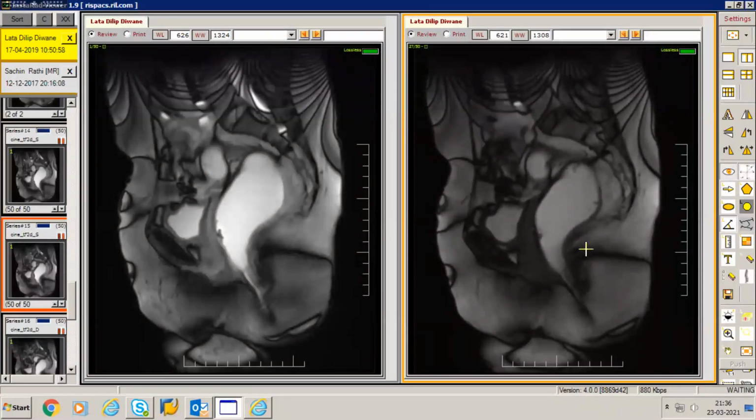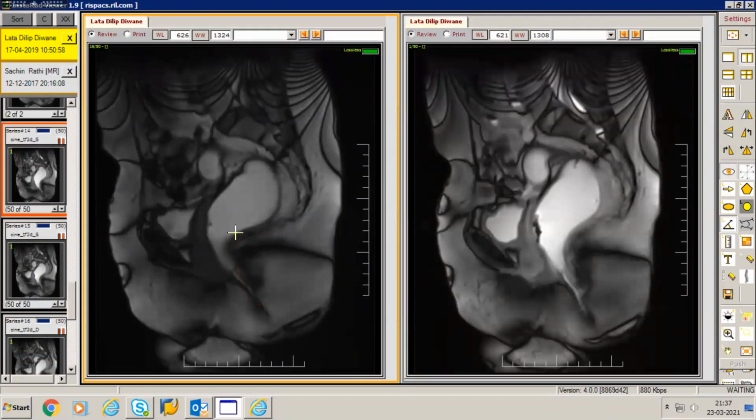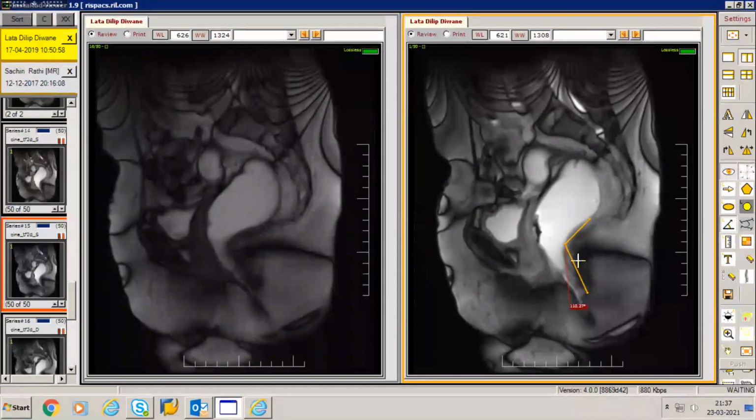Yeah, so now if you can appreciate, the same pelvic floor muscles appear slightly to be getting displaced inferiorly. Whereas if you look at the image higher up over here, the puborectalis sling had elevated the pelvic floor, and the entire anorectum was getting pushed upwards. On the strain phase, the pelvic floor muscles tend to relax or go more inferiorly, and you would see a slight descent of the anorectum in this phase. Again, if you look at the anorectal angle over here, drawing from the long axis of the anal canal with the posterior margin of the rectum, it would subtend a more obtuse angle between the two of them.